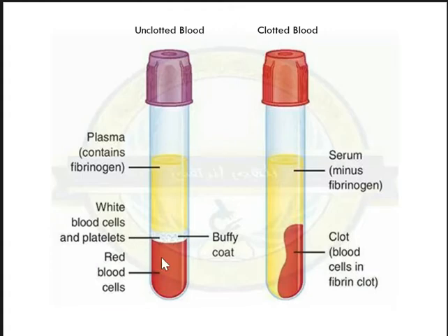Dili na siya katong murag liquid or viscous form. Magtikubol na siya diri. So, na-used up man ang fibrinogen because na-clot man siya. So, meaning, ang kanisya na portion nato diri, wala na siya fibrinogen. Okay? So, I hope that makes sense.